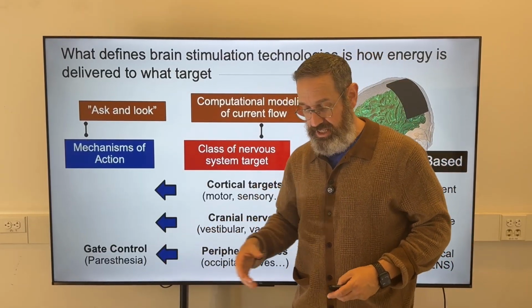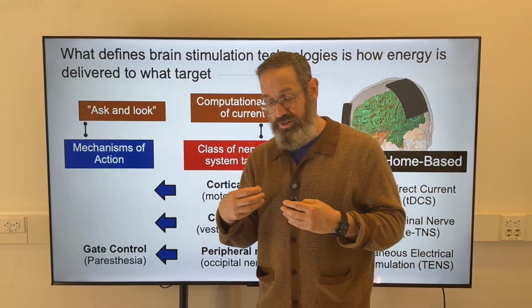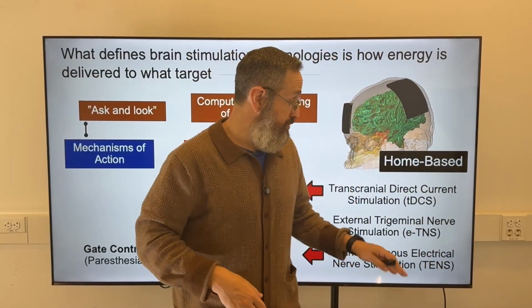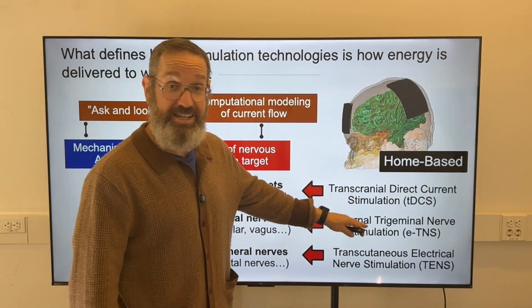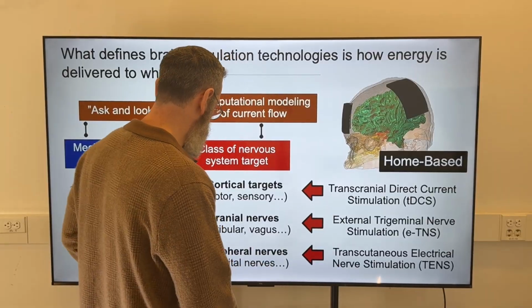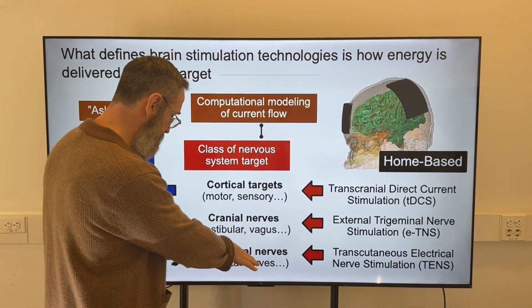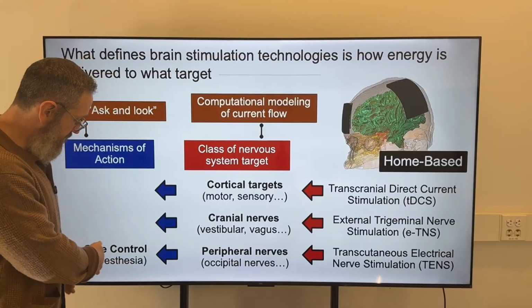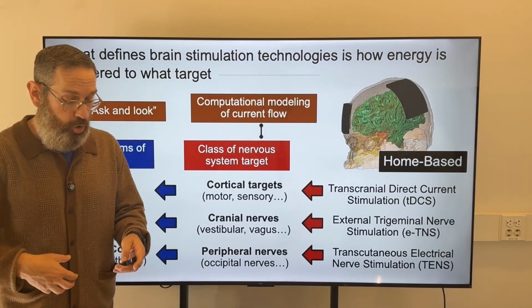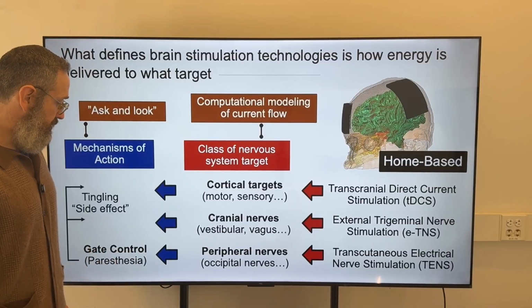It also explains why with TENS we put the device over the part of the body that hurts. So particularly for TENS, this wasn't necessarily the case for these other technologies. With TENS, based on the fact that we think it affects the peripheral nervous system, and we have this gate control theory, we would put the device over whichever part of the body happens to hurt.